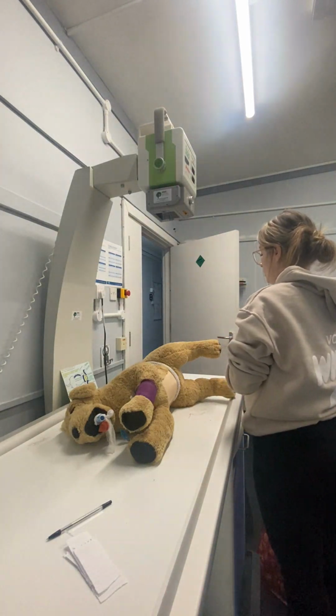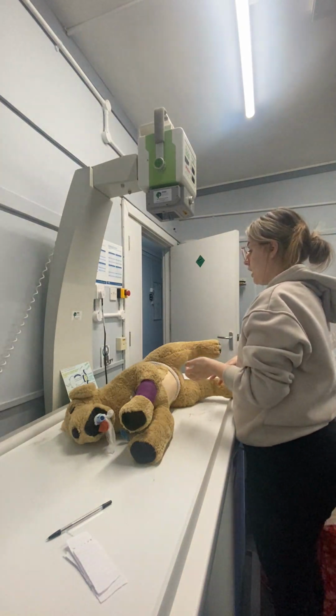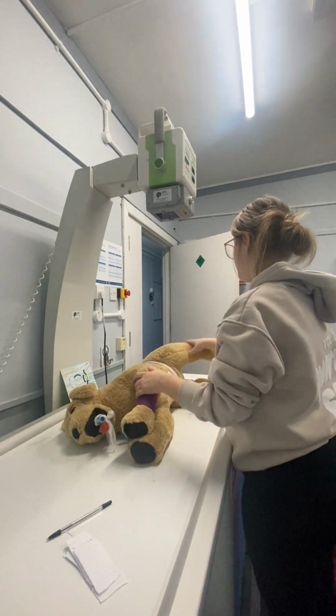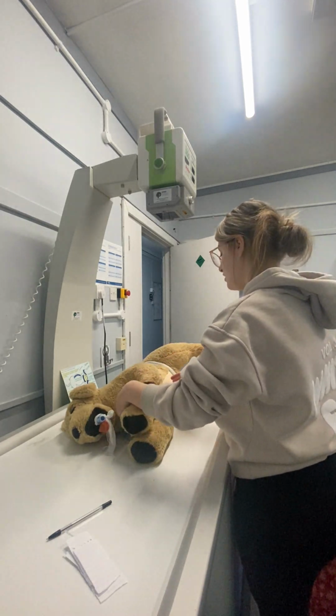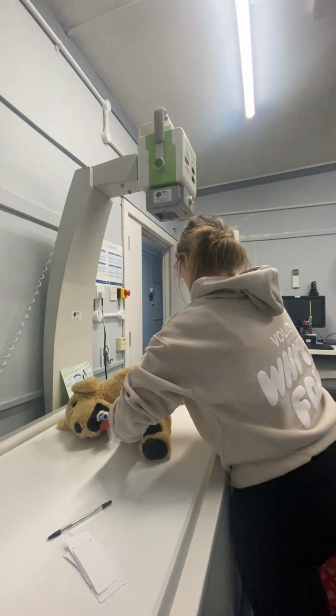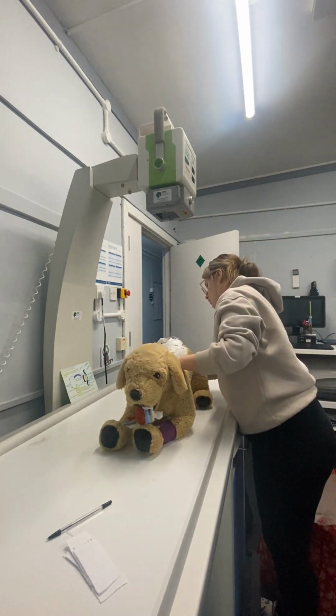If you're happy to help me move the patient into sternal recumbency, on 3, I'm going to take the front if you're happy to take the back, and then on 3 if you're happy to help me turn him onto his tummy. So 1, 2, 3, thank you. I'm just going to make sure he's in the crouched position.